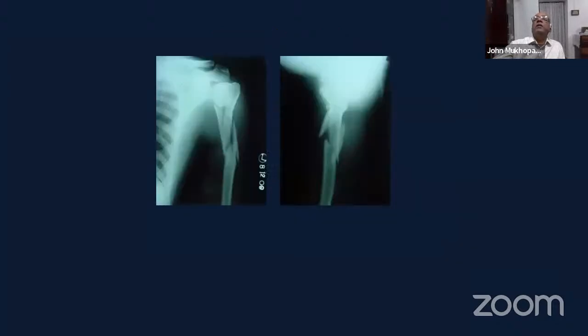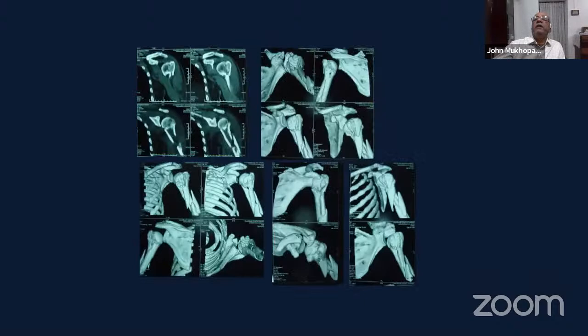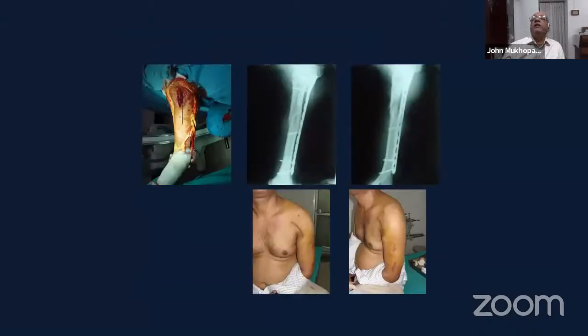Okay, so here's the patient. This is the patient where you can see comminution. There's no significant intra-articular extension, although the fracture is very comminuted and very proximal. There are no head split fragments as such, but a large tuberosity fragment. And you can get that provisionally reduced.